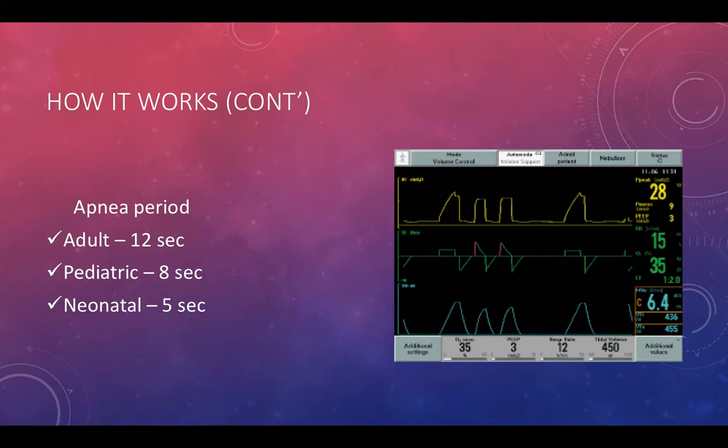Apnea period. This is the time when no patient effort is detected by the vent, and results in switching from a support mode back to a control mode. For adult, it's 12 seconds, pediatric 8 seconds, neonatal 5 seconds.